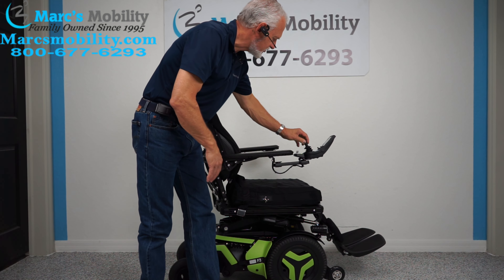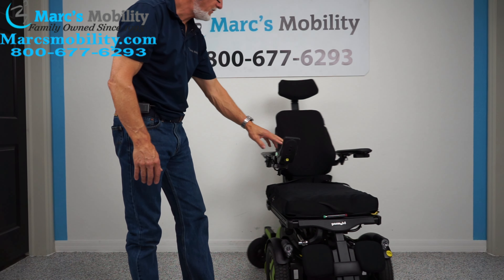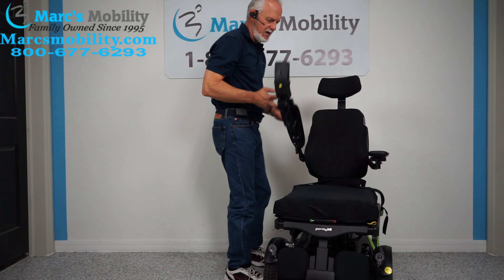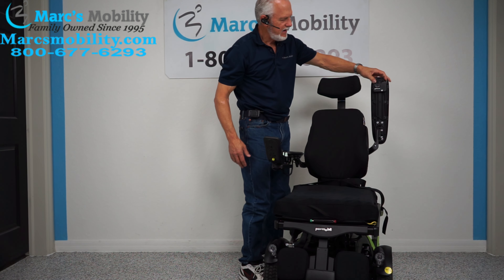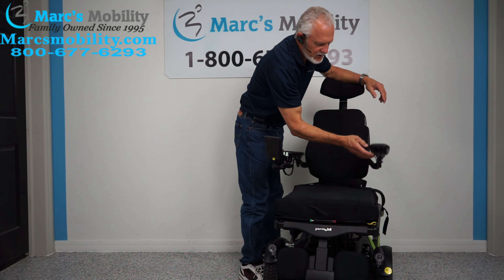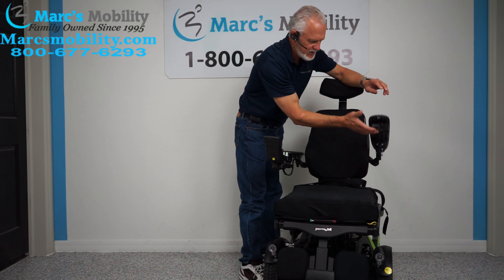Those are your five electrical functions. Let's look at the front of the chair. These arms do flip up, so if you transfer from the side, both arms flip up. And right here on this arm, there's a USB port — so if you need to charge your phone, you can charge it right through this USB port.